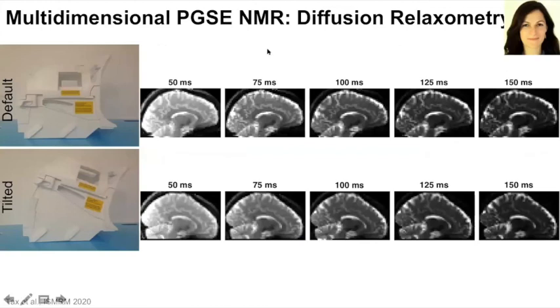Then another project, which we will present this year at ISMRM, is together with Elena Kleban. We have a tiltable coil in Cardiff that we could use within the connectome. It's a 20 channel head coil. This coil allows you to tilt by 7 degrees, 9 degrees and 18 degrees, and was originally designed for patient comfort, so that they would be more comfortable when tilting.